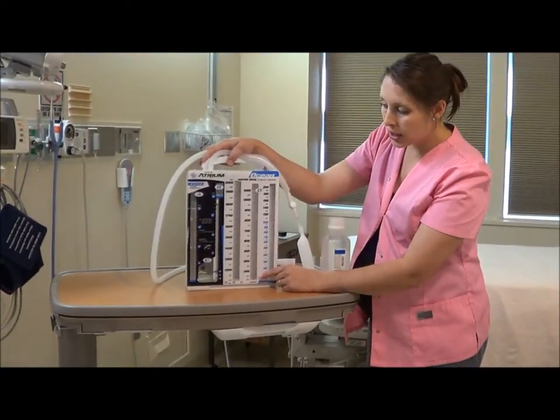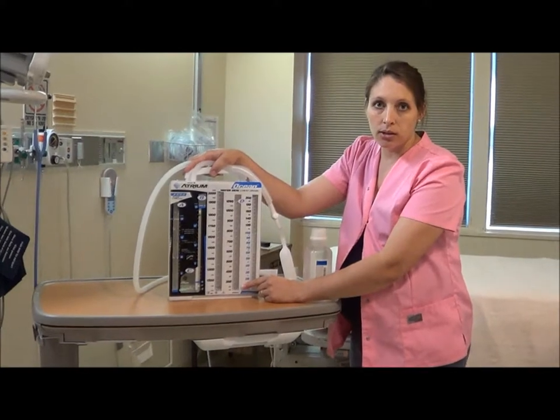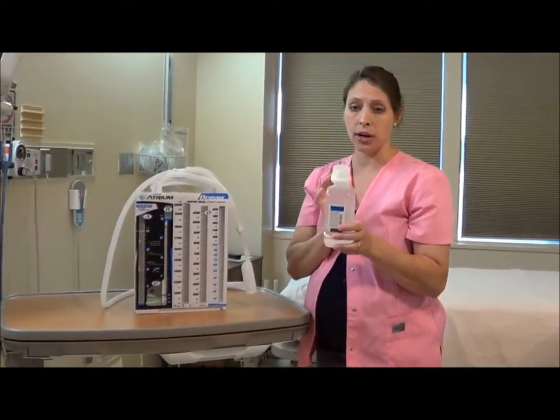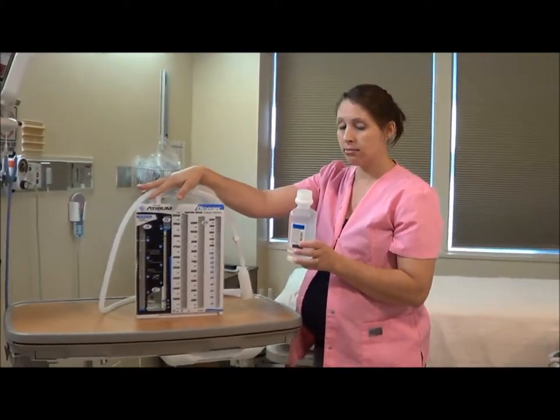We will need to fill two of these chambers to get it set up and ready for the patient. You need just some sterile water and the atrium itself.